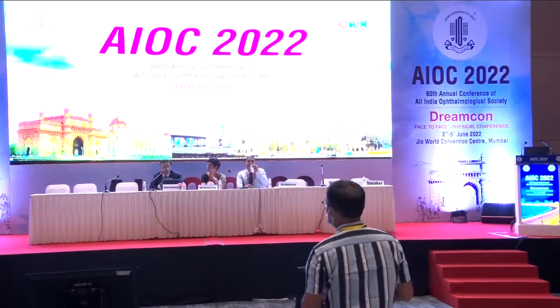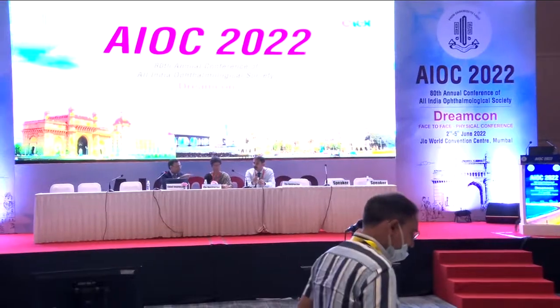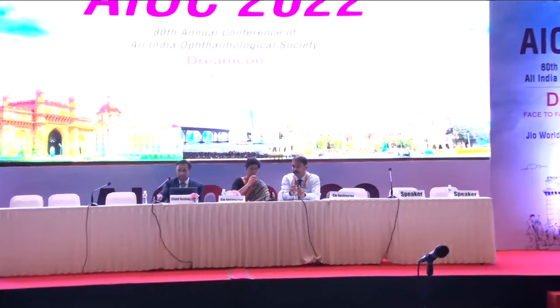Yeah, Dr. Gagan, I think Dr. Dhanashree had a similar question, so we'll club both the questions together. Dr. Ma'am also asked a similar question. Yeah, this is a very good question actually. Even I was looking at your videos and admiring the illumination, because even when you put the chandelier, although you can increase the intensity, sometimes you don't get a very diffuse good illumination. There is some part which is lighted and some part which is dark. So what is your trick in having a good illumination?